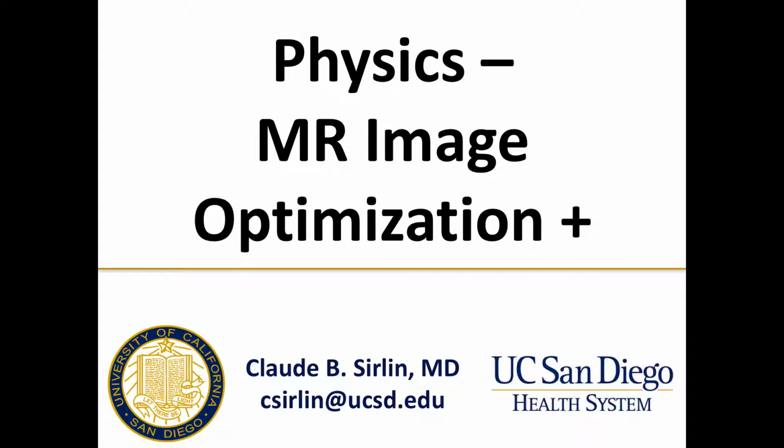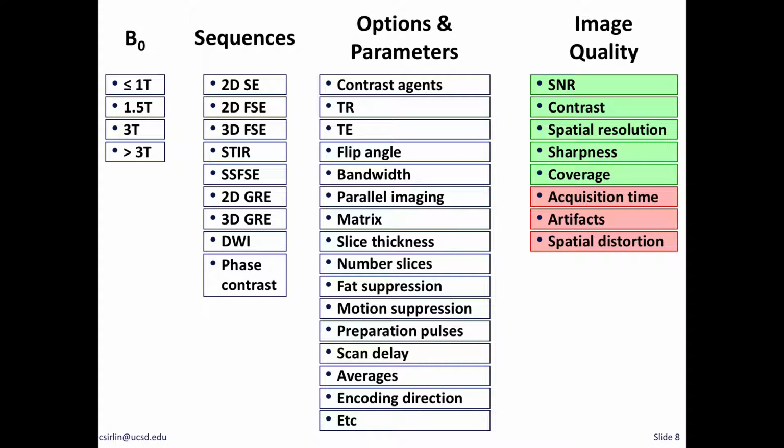Thank you for listening through that first lecture, which is on basics of MR physics. This is now taking some of that physics knowledge and applying it towards image optimization. So shown here is all the things, or many of the things, that factor into image optimization.